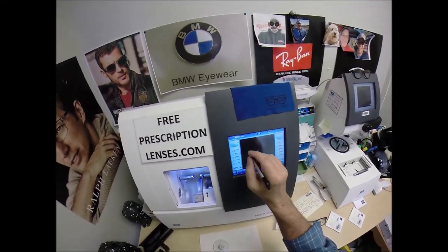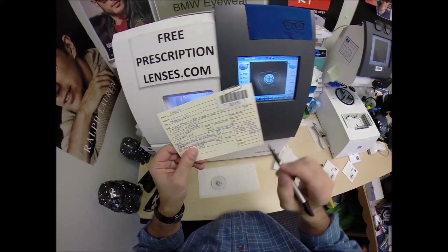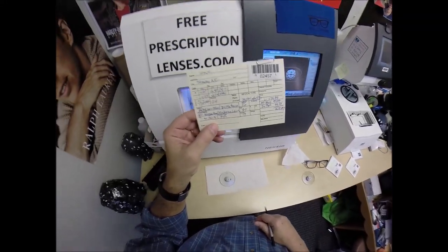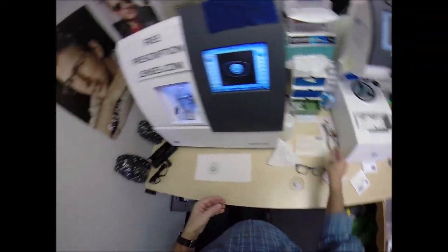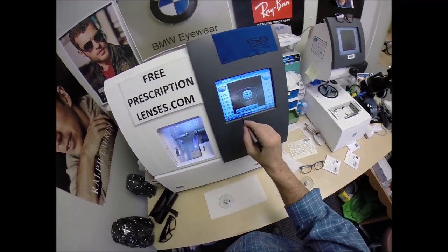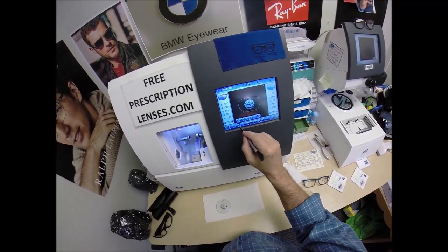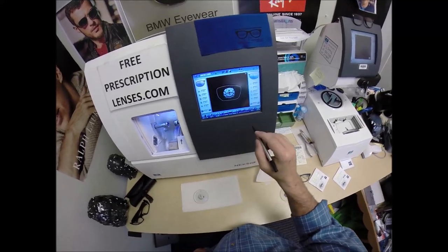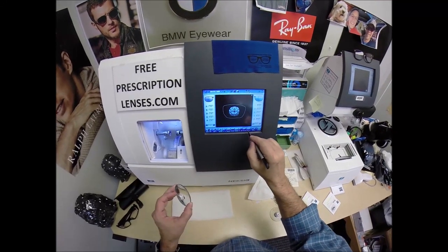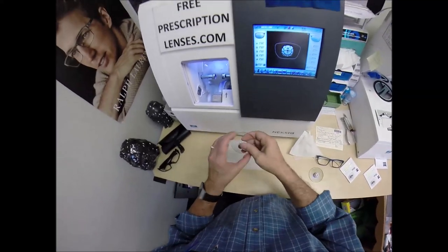I'm going to go ahead and wake up the computer — job ID number 2457. These are polycarbonate lenses. If they were plastic Hydex or Trivex I would select that, but we're going to stay with polycarbonate. I'm not going to polish the edge of the lens because it won't be seen. I'm not going to put a safety bevel on the front convex surface, but I am going to put one on the rear concave surface.